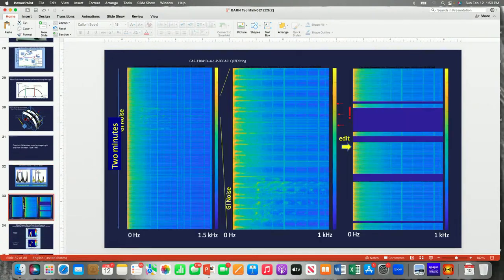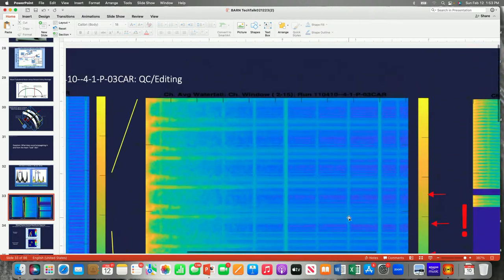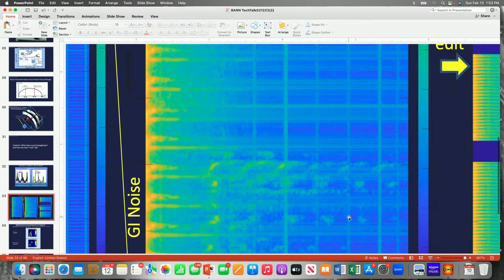The first thing we do is a spectrogram. Let me see if I can amplify this, because this is really interesting. This actually worked, not like my example today. Okay, this is cool. You have time on the vertical and frequency on the horizontal, and you can see the markers every 120 cycles. So we use that as markers. This is a stomach gurgle. See this? That's in slow motion what a gurgle looks like. So we have to get rid of that.